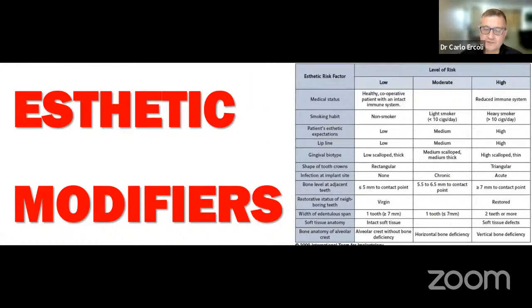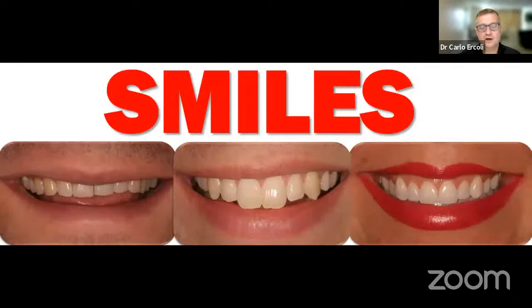And if you look at this classification from the International Team for Implantology, of which I'm proud to be a fellow, there are a number of things that you can look at. But realistically, the most important one you should be looking at is the characteristics of the smile. Is the patient a low smile, like I am? About 20% of individuals have the smile that you see on the left side. But about 60 to 70% of individuals have the smile that you see in the middle, where now not only a patient will show the tooth, but will also show the characteristics of the papilla. And then there is about 10 or 20% of the population which really has a high smile line and shows completely the interface of the transition area between the soft tissue and the crown. And of course, those are the most difficult patients to deal with in terms of aesthetics.